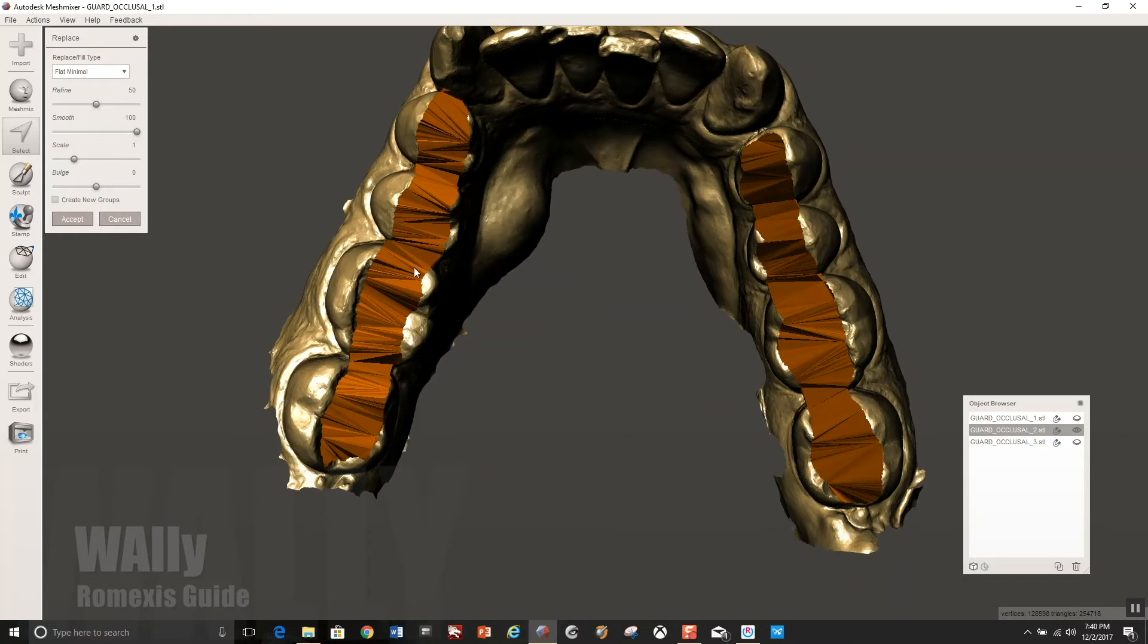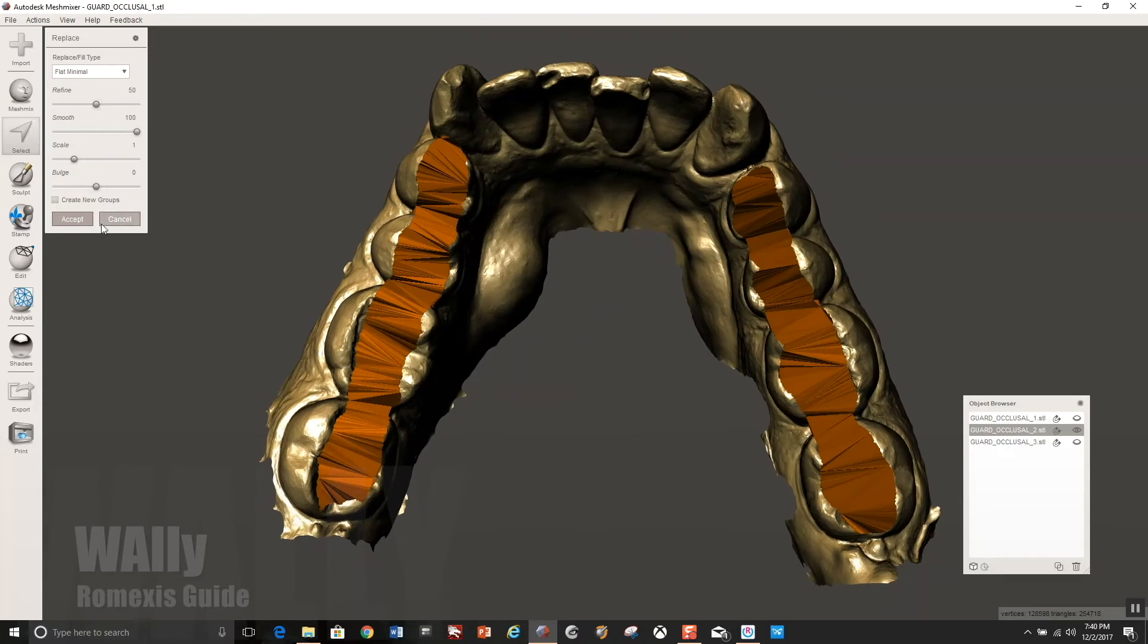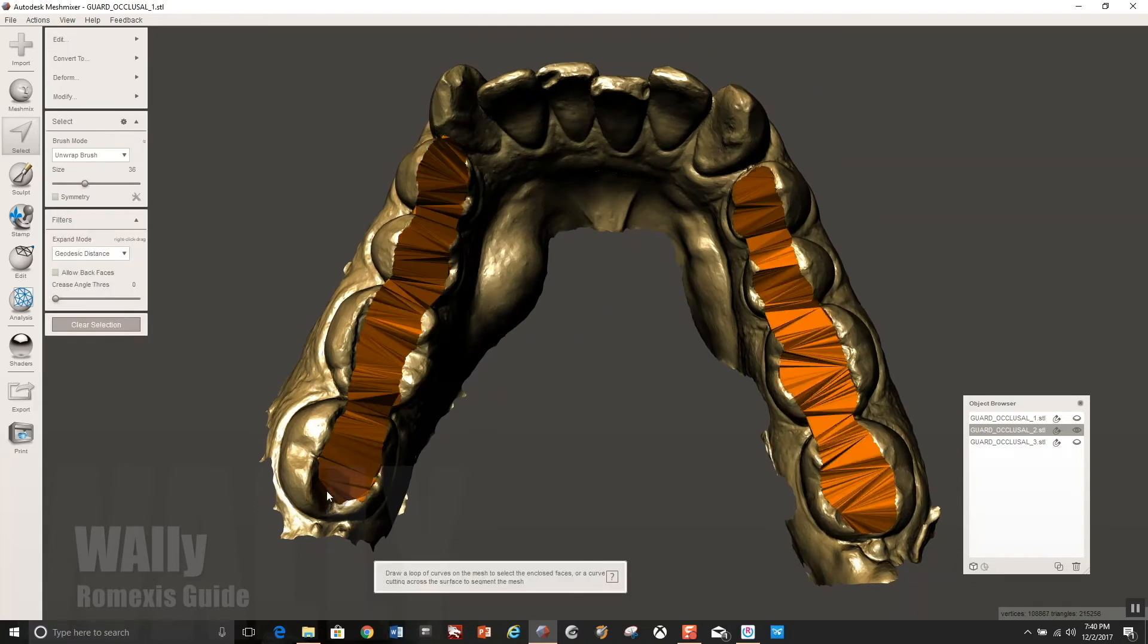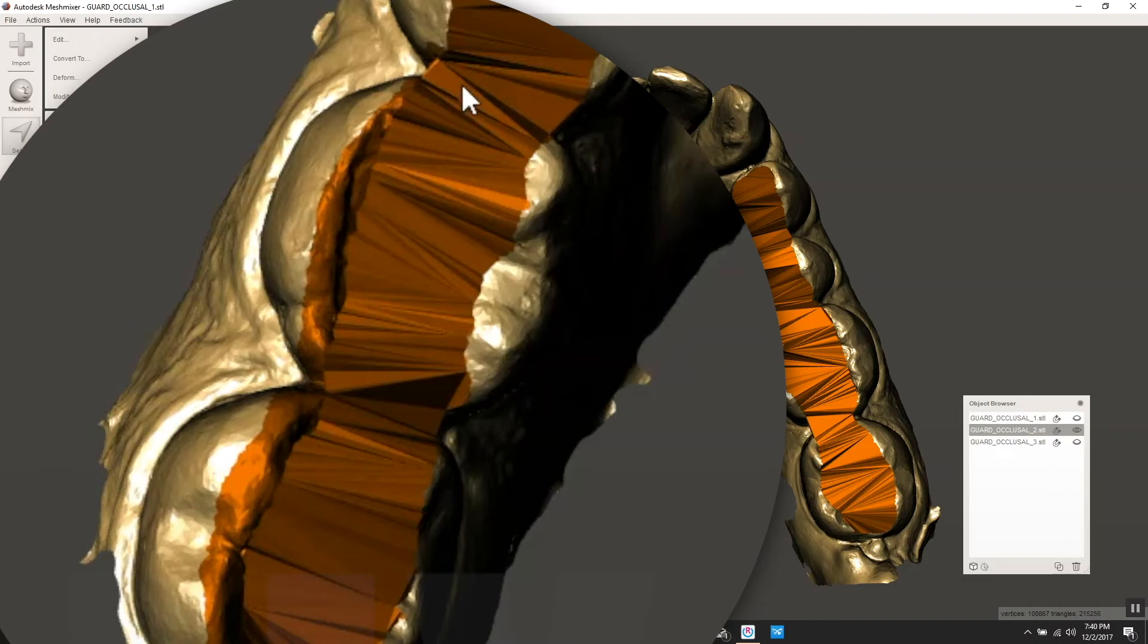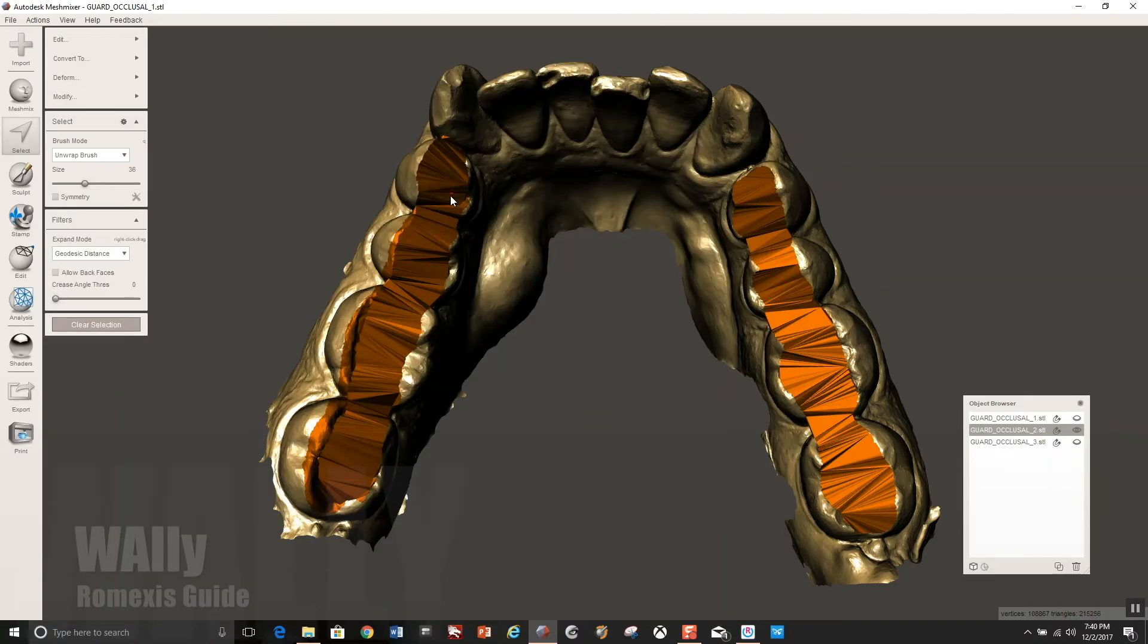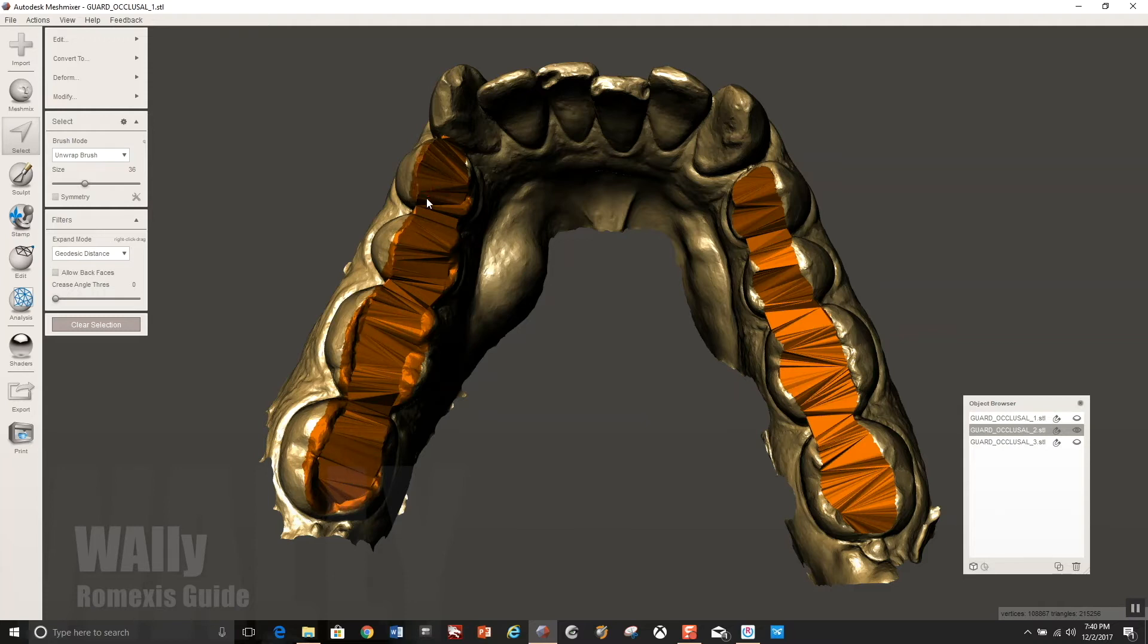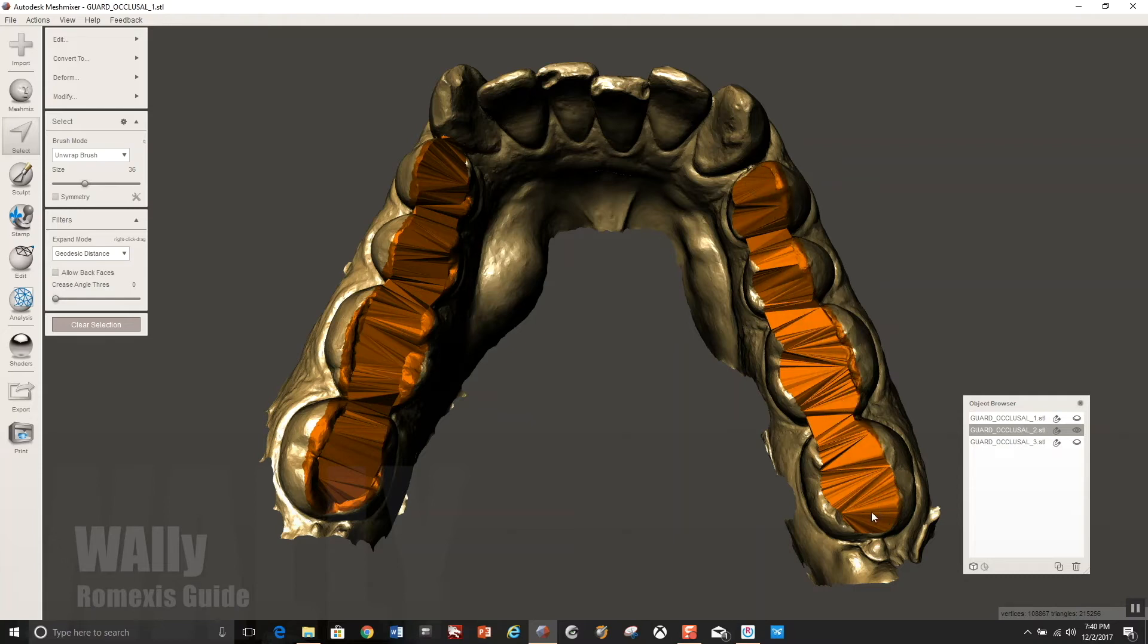But before you section this out, you're going to want to select now the cusps tips. Because remember, you're going to eventually indent the occlusal guard with whatever is selected here. And so you do want to be careful not to go over onto the facial and lingual surfaces too much because you don't want to lock the patient. And depending on your philosophy, some people don't, it doesn't matter, whatever works for you. But here I'm just trying to get it to where the cusps tips will indent into the guard ever so slightly.